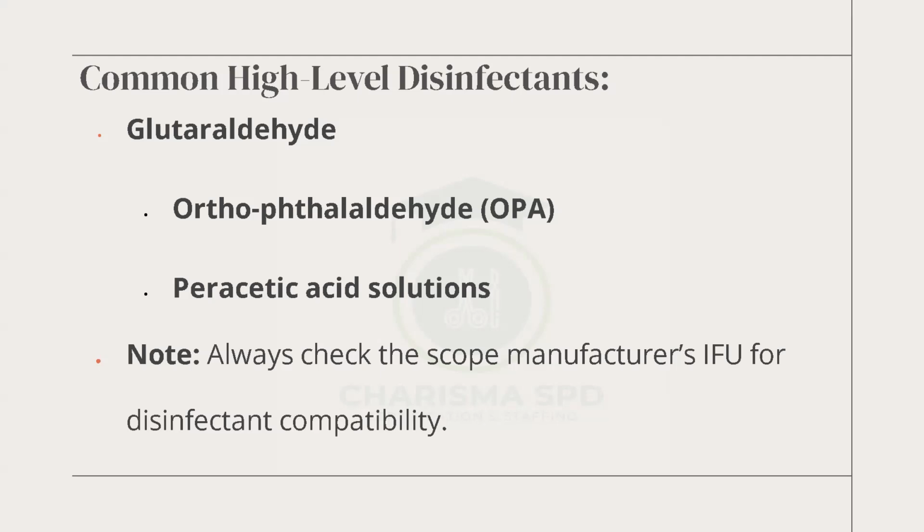Always check the scope manufacturer's IFU for disinfecting compatibility. All that I've said will be given by the IFU. Next slide.